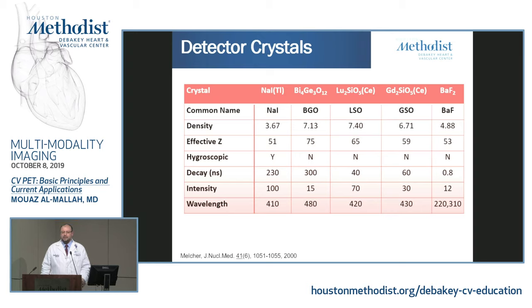It will be interesting for those of you who are interested in this to go at one time and visit some of these, if you are looking for a machine, to see how they grow them. It's a very interesting experience because they have to grow them with different special characteristics, and sometimes they get impurities in there that they need to take out to make sure that the detector is pure.